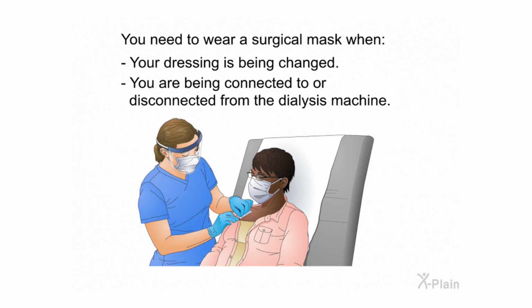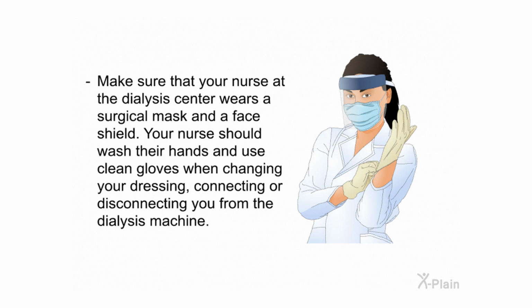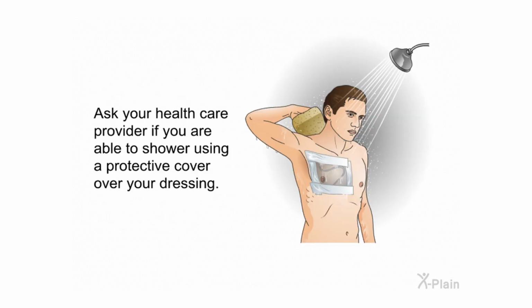You need to wear a surgical mask when your dressing is being changed, or when you are being connected to or disconnected from the dialysis machine. Make sure that your nurse at the dialysis center wears a surgical mask and a face shield. Your nurse should wash their hands and use clean gloves when changing your dressing, connecting, or disconnecting you from the dialysis machine. Ask your healthcare provider if you are able to shower using a protective cover over your dressing.